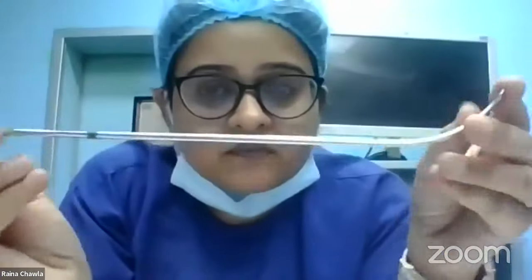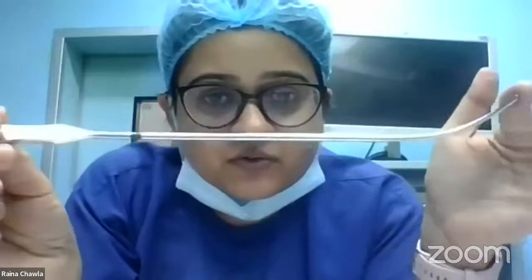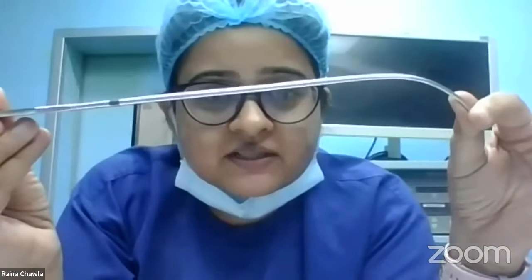Okay. The next instrument, let's go and order this instrument. What is this? This is a uterine sound. Okay, so uterine sound, again, you can see it's a long instrument. It's a thin instrument. It has a slight curve at the end. This is because the uterus is not straight. The uterus is antiverted or retroverted. So according to the axis of the uterus, the instrument is introduced.